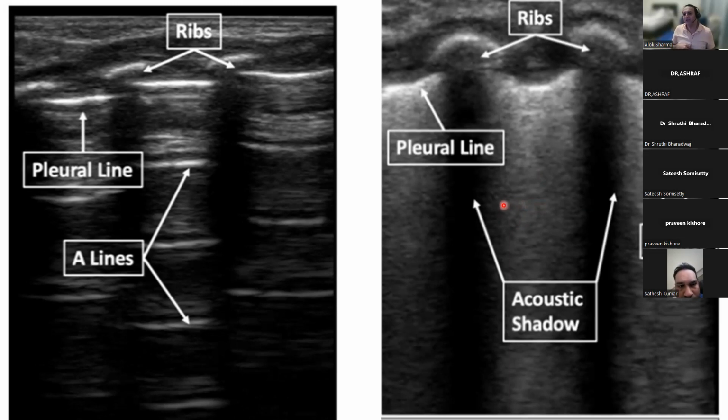The problem with just using FiO2 in this particular situation is that what if the baby has a pneumothorax? What if this baby has a lot of fluid because he's an elective cesarean in the first 2 hours? What if this baby has elevated pulmonary pressures because he's perinatally compromised and he's been born in a setting where he's got an element of perinatal stress?